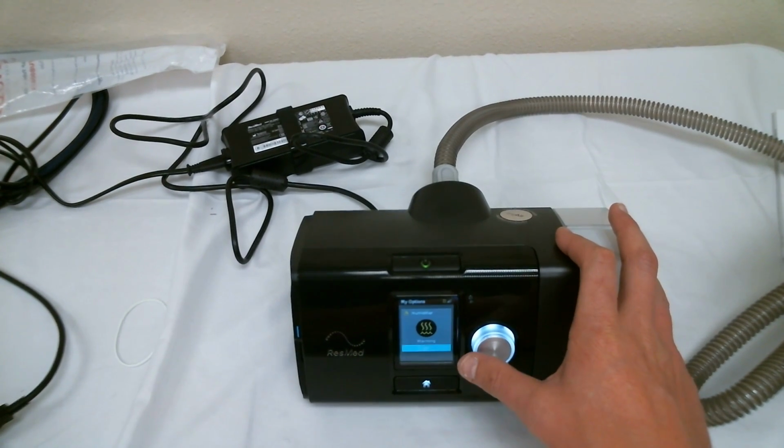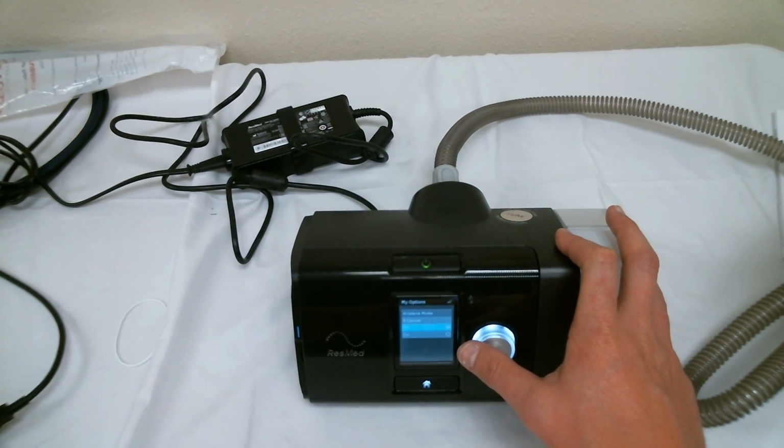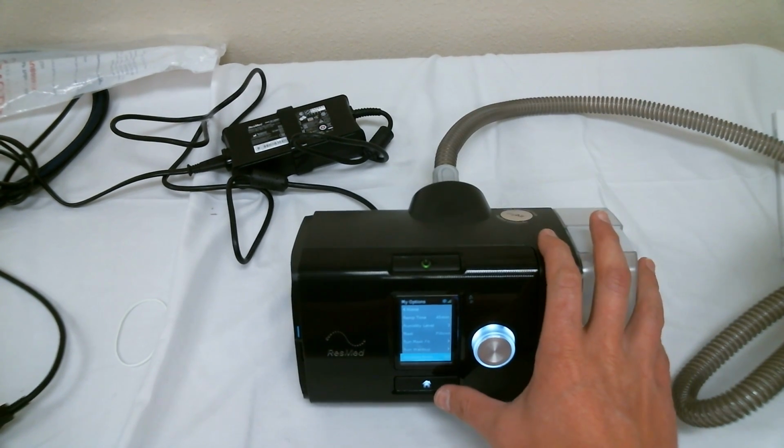Run Warm-Up allows you to preheat your humidifier for max humidity upon turning on your device. To start, press once. To stop, press again. The last selection on your options menu is airplane mode. This is much like airplane mode on your cell phone. To disable the cell network, turn it on, but keep in mind that turning on airplane mode will restrict your use of the myAir app and your provider's access to your data. Press home once you've completed your changes.